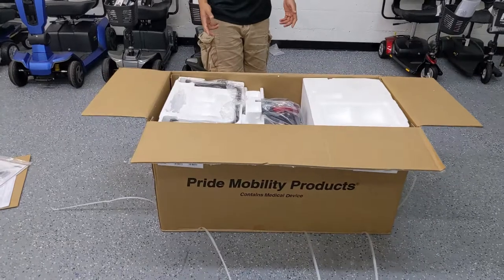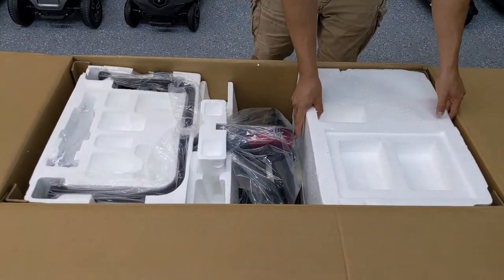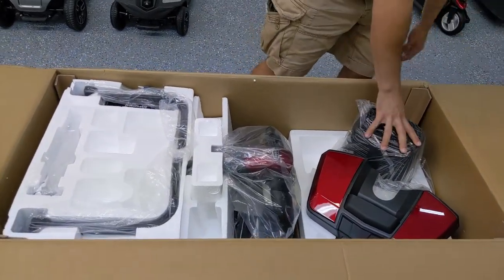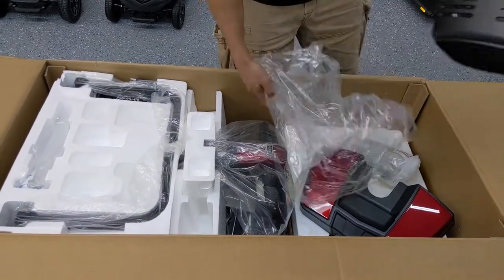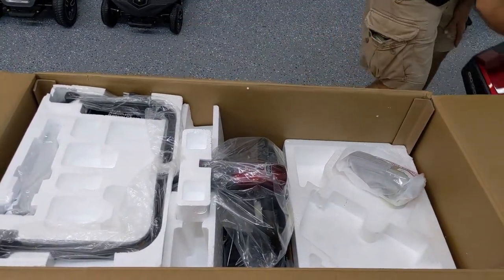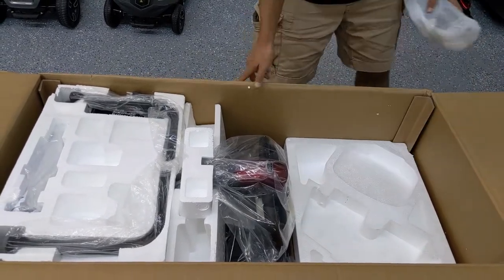You can see that this Gogo scooter has been packaged very professionally. It's got styrofoam molding on the top of the battery box and the basket to keep it protected. Pride does the best job at packaging their products compared to any other manufacturer in my opinion.